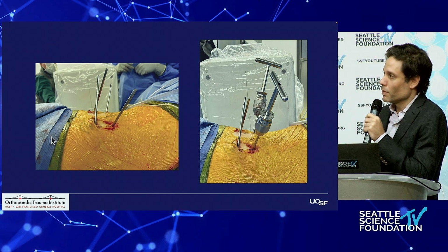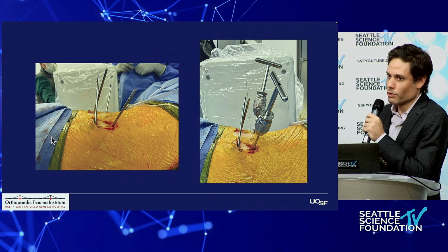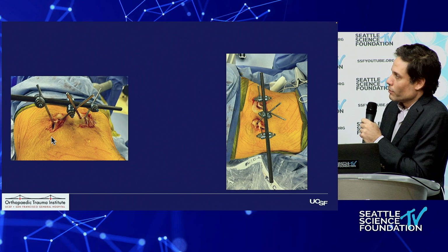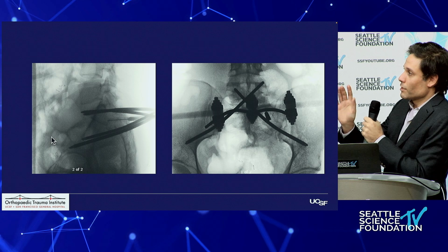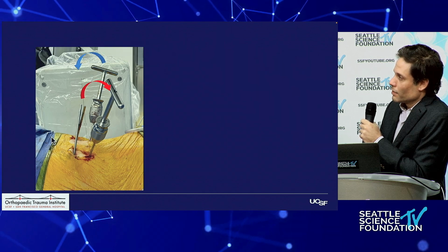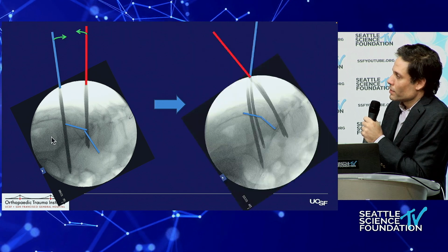So this is sort of what we ended up with. Of course, at 5 days, she wasn't mobilizing. So here you see two X-fix pins. The ones on the right side of the screen, converging towards the midline, are going down into the S1 pedicle. And then you have the iliac pins, and from there we try to get it reduced, and we'll show you what this means here. We're trying to essentially get lordosis across those pins. So there's the position, you push them both ways, and you can see the resulting lordosis. We didn't get a full correction, but we corrected her deformity from about 40 degrees to 20 degrees.